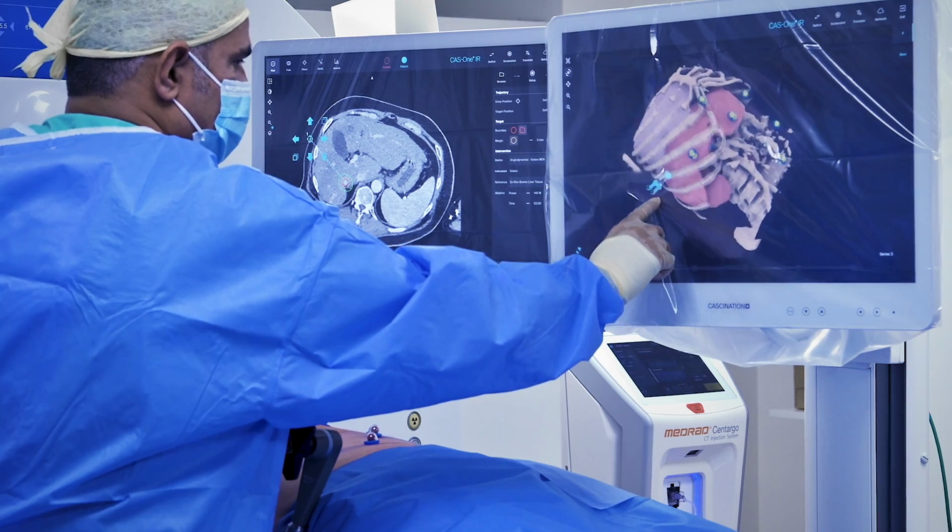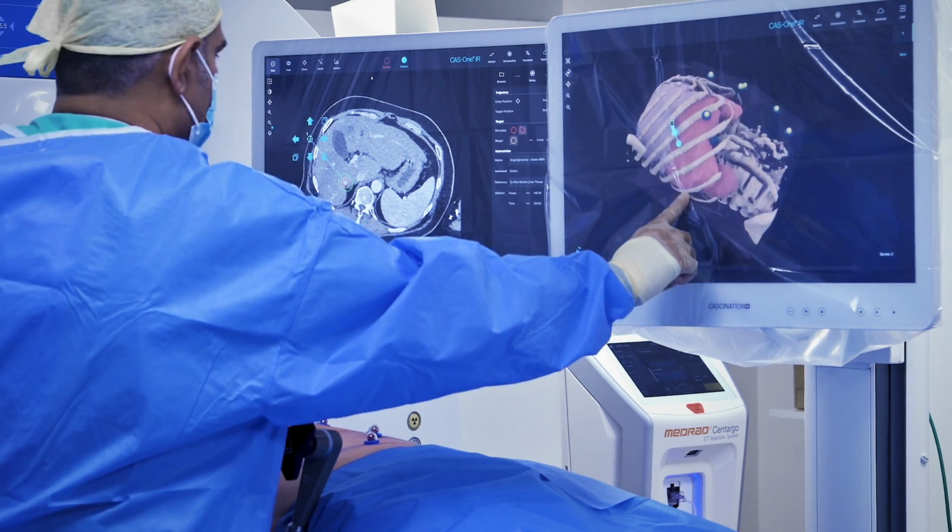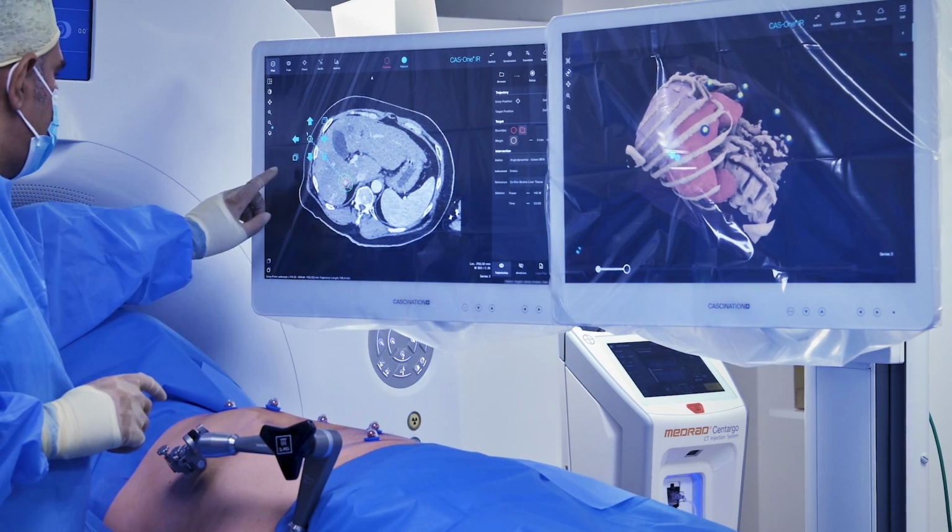I'm just looking again at the entry point. You can see that I'm quite close to a rib there, so again, slightly want to adjust that.